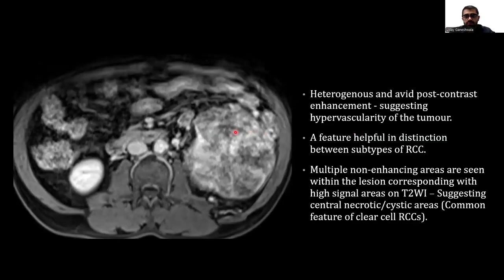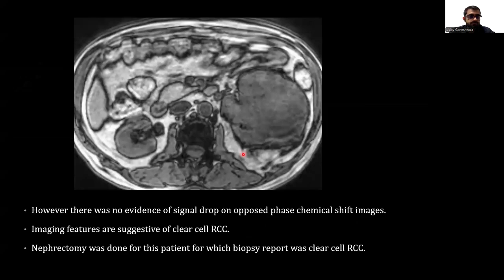Heterogeneous and avid post-contrast enhancement is noted suggesting hypervascularity of the tumor, a feature helpful in distinction between subtypes of RCC. Multiple non-enhancing areas are seen within the lesion with high signal areas on T2-weighted images suggesting central necrotic or cystic areas, a common feature of clear cell type RCC. However, there was no evidence of signal drop on opposed-phase chemical shift images. Imaging features are suggestive of clear cell type RCC. Nephrectomy was done for this patient, and biopsy confirmed clear cell type RCC.